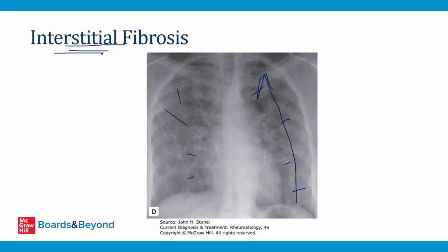And trust me when I tell you this, throughout training, even at the intern and resident and sometimes attending level, you will always use patient clues to interpret images. There are many different findings on images, whether it's X-ray or CT scan or MRI, that can look alike. And much of the way you tell one from another is by knowing the history of the patient to know which finding is more likely.